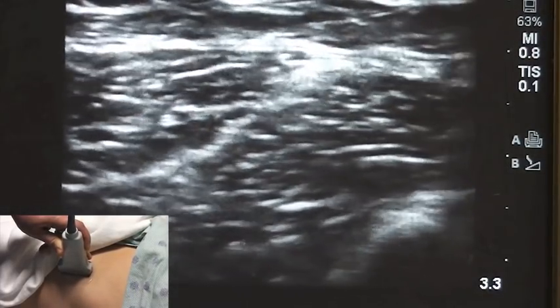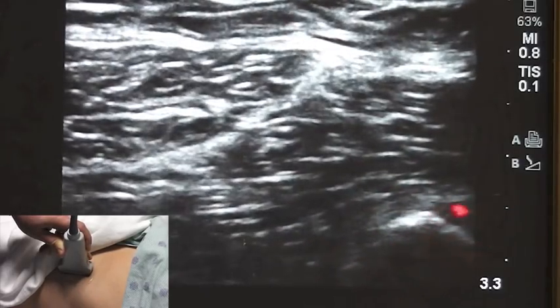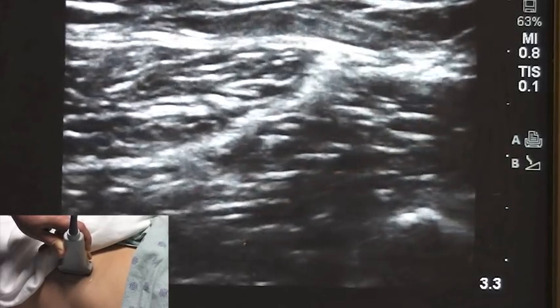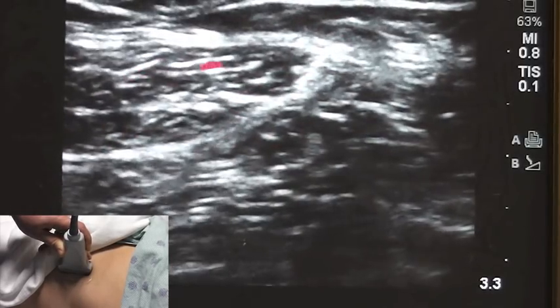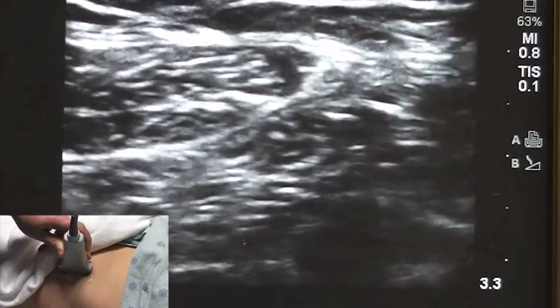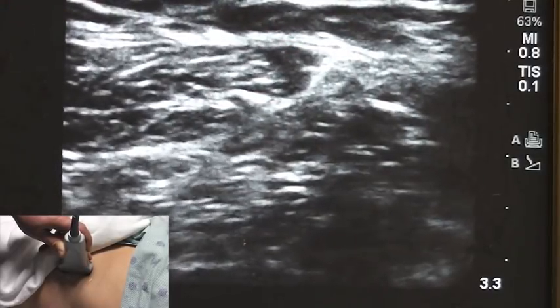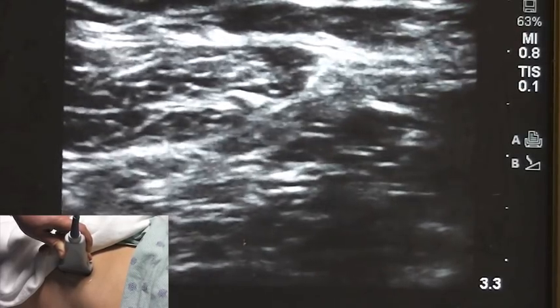As I do that, you can see some structures coming into view. On the ultrasound you can see the ilium. On top of it there is the iliacus muscle, and there is a muscle at 3 o'clock which is the internal oblique muscle. For the purpose of this demonstration, the left side of the screen is cephalad and the right side of the screen is caudad.